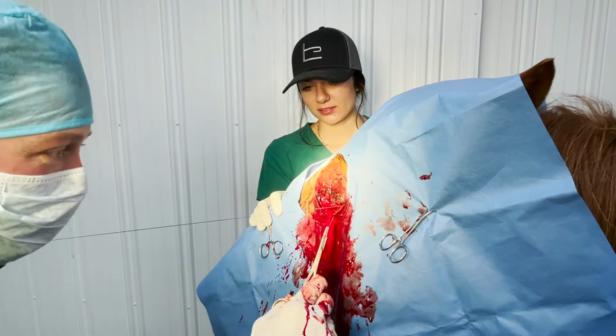Does the blood that stays pooled in the socket form any type of calcium ball or anything? It'll form a big clot, and it'll look like she's got a fake eye behind there for a while, then it'll slowly absorb. So you're suturing it from the inside out? I'm doing that fascia on the inside, yeah, then I'll do 2 skin layers. Okay. Sub-Q, then a skin layer.